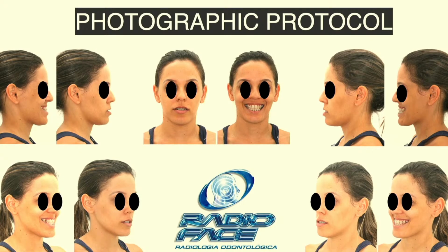I don't do any kind of facial analysis with photos or images of the patient. They help me just in the diagnosis, but I like to see my patient and touch my patient with my hands so I can view all the posture of the patient, the cervical spine of the patient, and I change the head position of my patient and try to see the best position to do the measurements of that face. And it is very important.